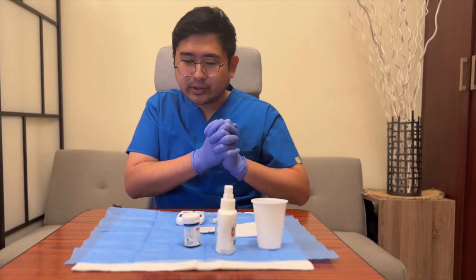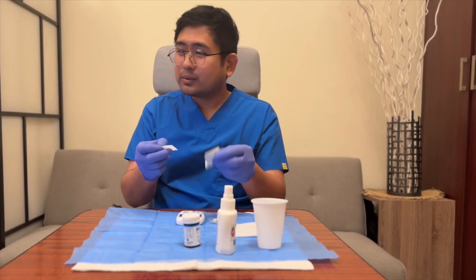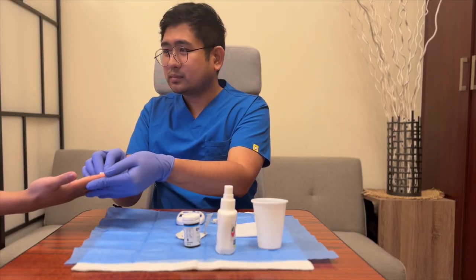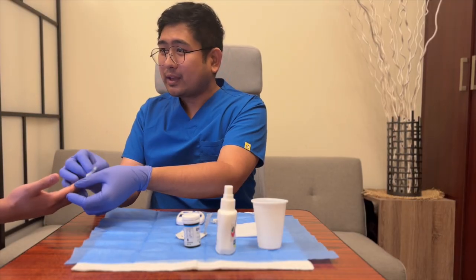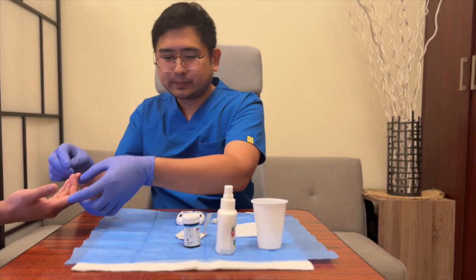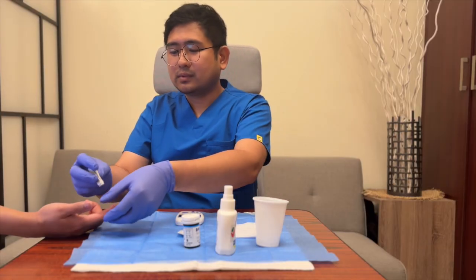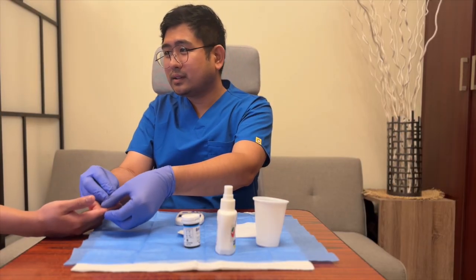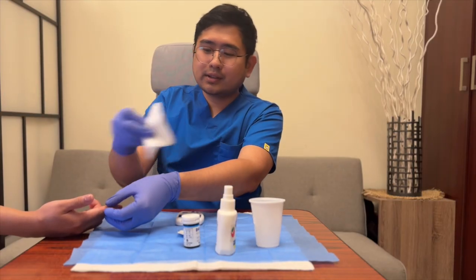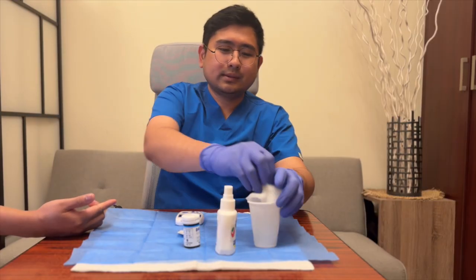Alright, I've got all the equipment ready. I'll just wipe your finger with alcohol, and wait a few seconds to dry it so it doesn't affect the result. Okay, 3, 2, 1. Alright. I'm wiping the first drop of blood and I'll be collecting the second one.